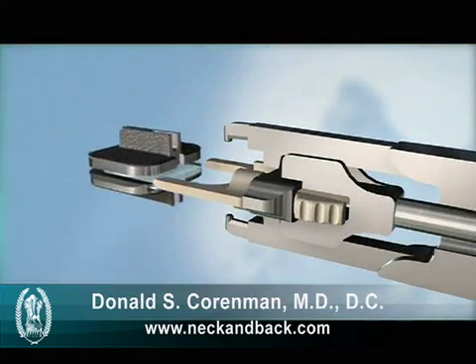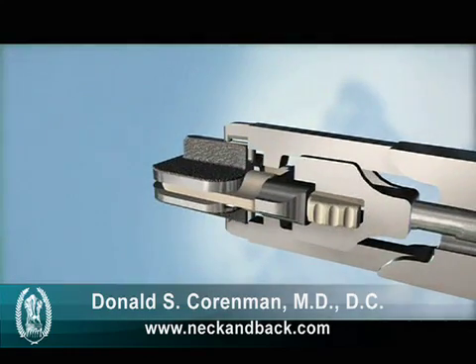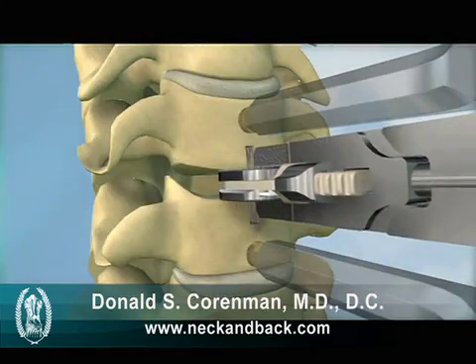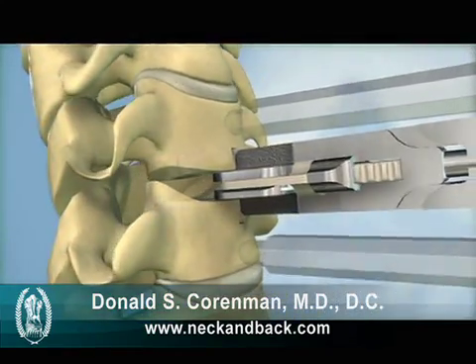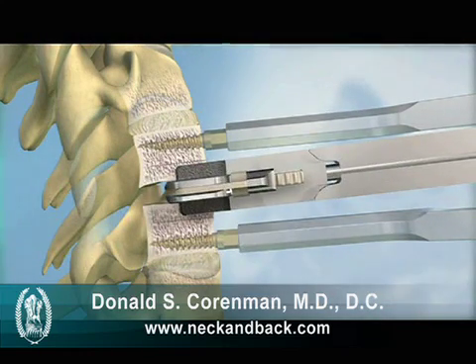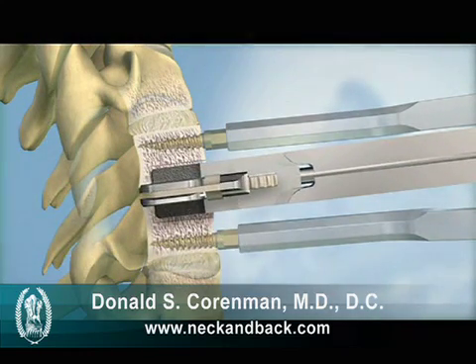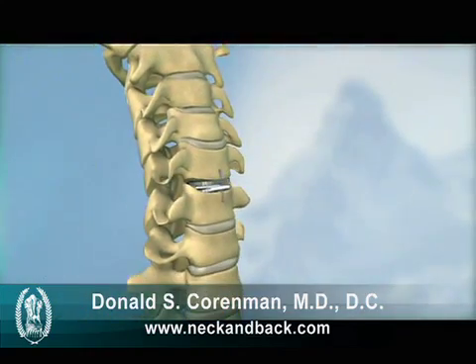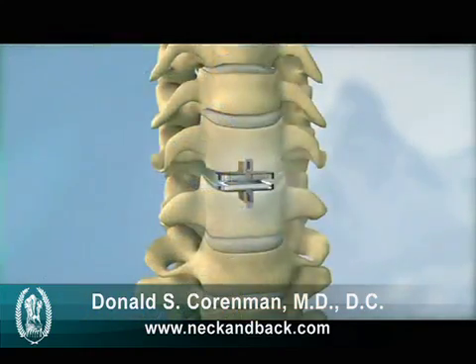After the keel channels have been prepared, the vertebral bodies are ready to be implanted with the ProDiscC implant. The implant is attached to the inserter, the keels are aligned with the keel channels, and the implant is inserted en bloc into the vertebral bodies. The instruments are removed and the final implant placement is confirmed.